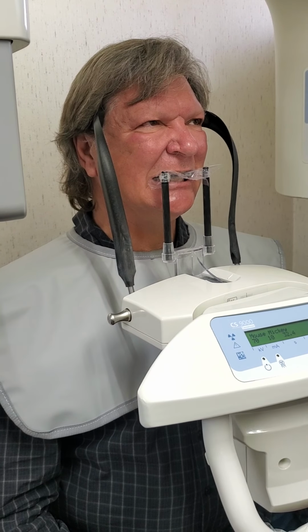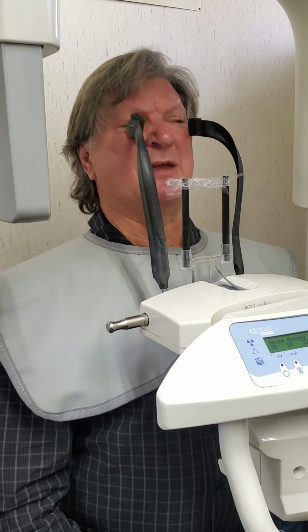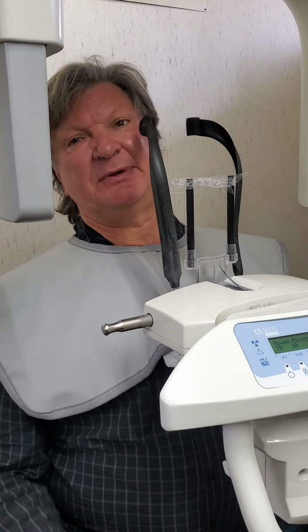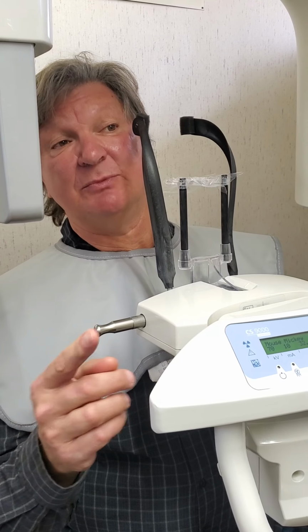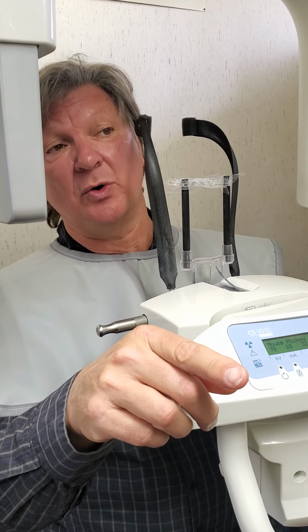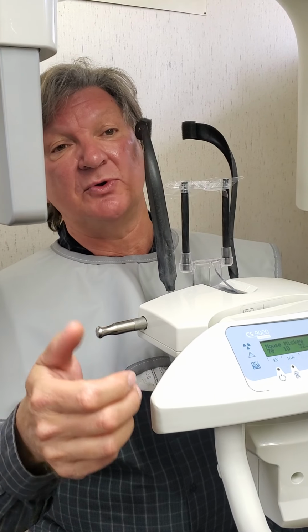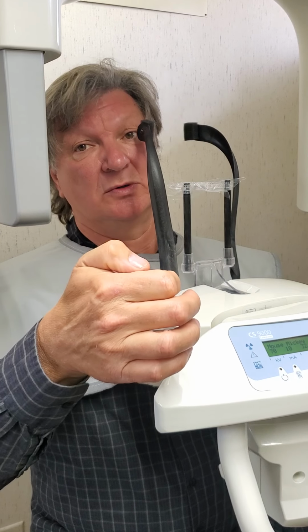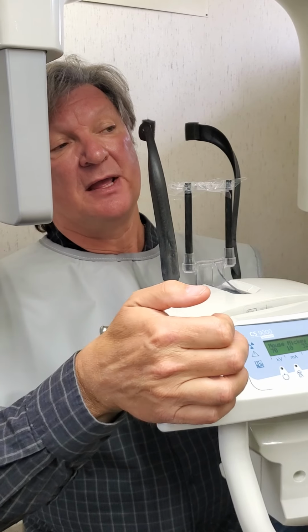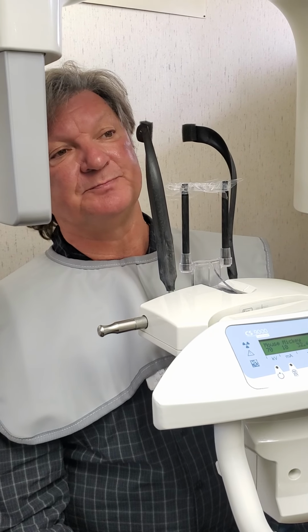You want to try it? You want to? Well, if we do it, why would we do it? We would do it because you guys may not have seen the machine move. You may not see the screen that says stop and go, because you have to do that. And it's uncomfortable, I think, when people do this because they don't know when to let go of the button. And so I think knowing when to let go of the button is a good thing to do. Yeah, I agree. Right, Dan?